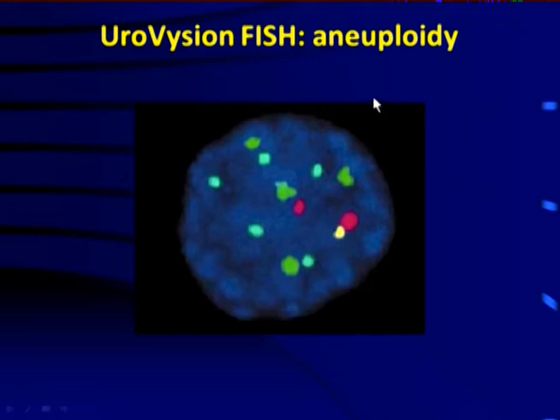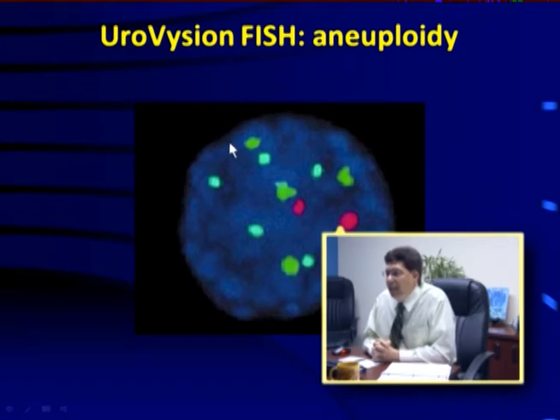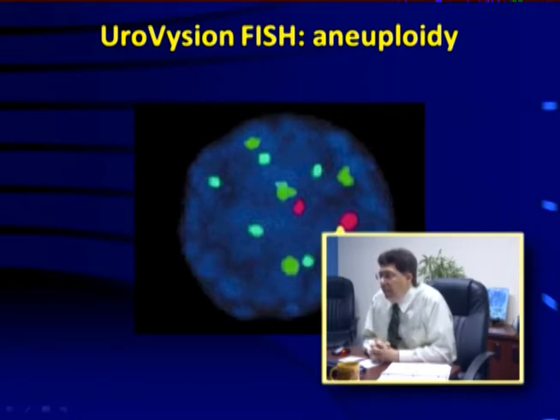There is one caveat, and that is we can't stop at 25. The FDA requires that we scan the entire spot that we put on the slide. So if you spot a thin prep slide with a 22 to 24 millimeter diameter, you're going to be doing a lot of scanning. We have gotten that spot down from 24 millimeters to 18 millimeters to 12 millimeters. So we try to enrich the area, and more likely than not, you're going to see more than 1 cell in a photograph, even though these specimens are for the most part hypocellular.